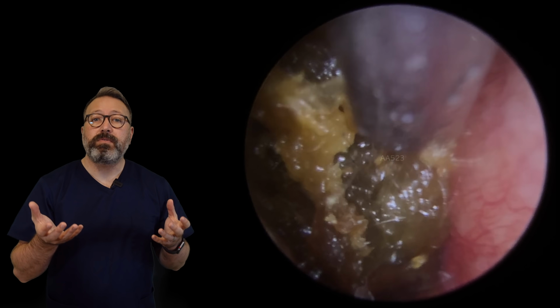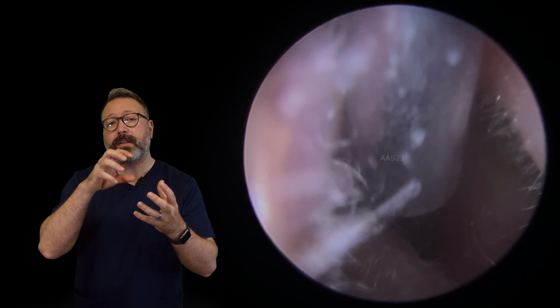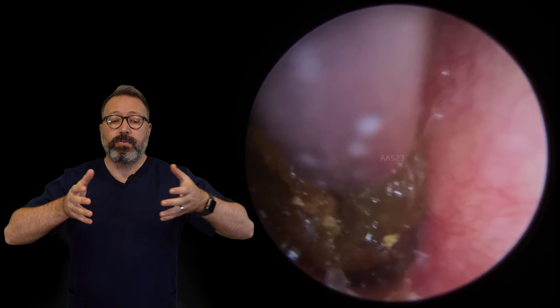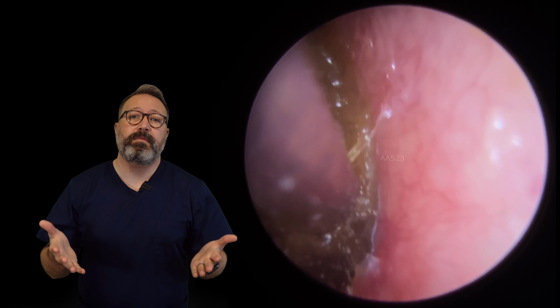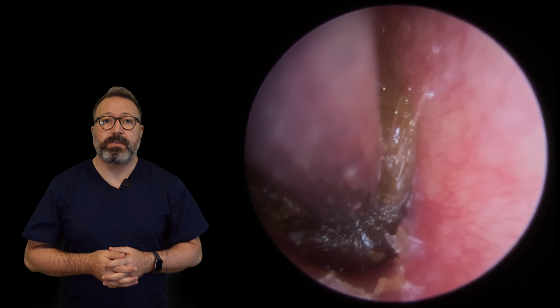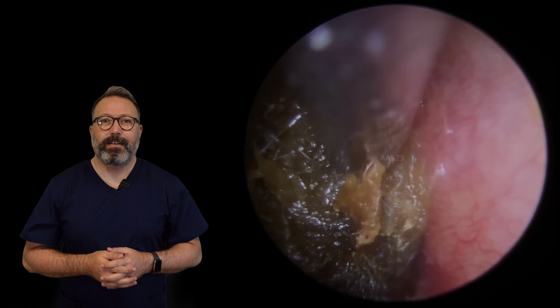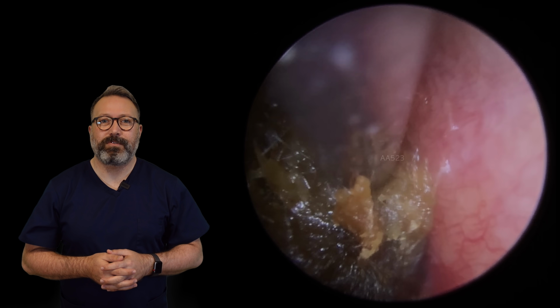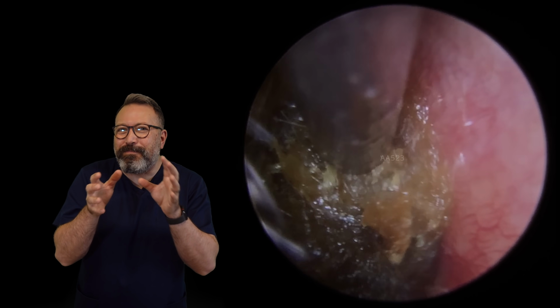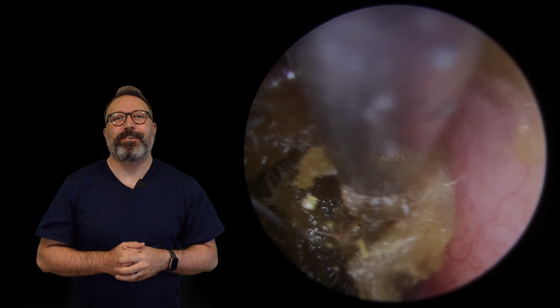The reason we've got to do that is if it's holding onto the canal wall in those thin layers, when we get that central plug and start to pull it, those thin layers on the side are going to hold everything in place. So we're just going to work on this. Oh, is it going to come away? Or not quite. It's getting a little bit of movement there. I can just see it starting to move. It's coming. Top section broke away.